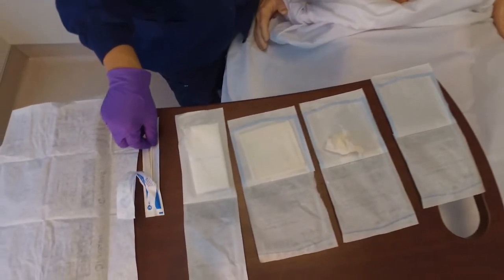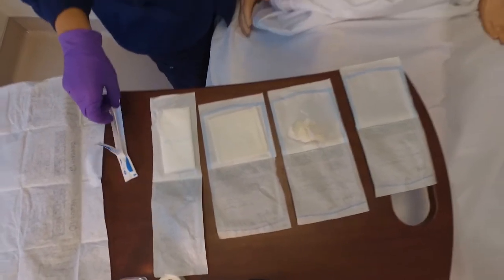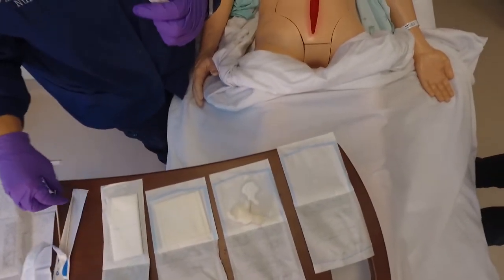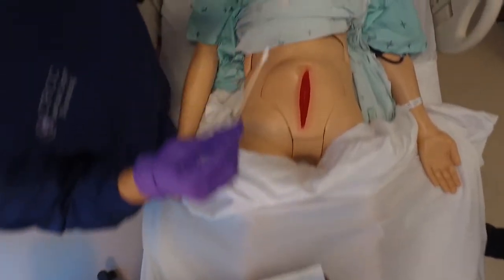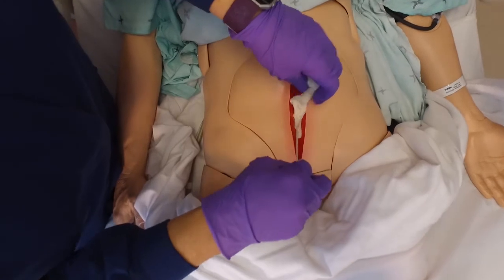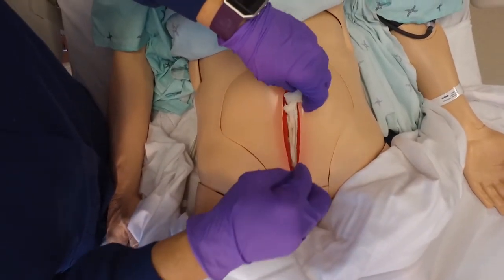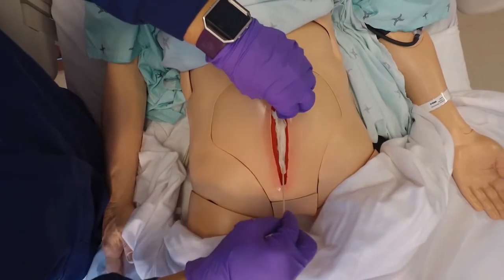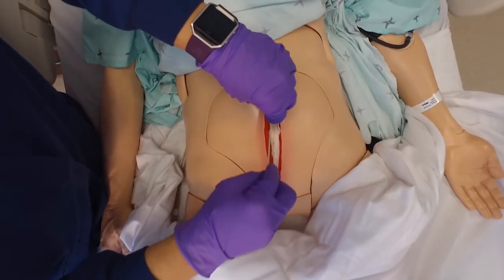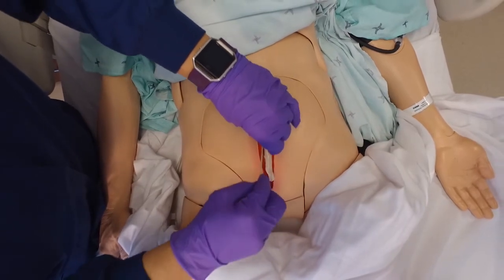The nurse applies a single layer of gauze to the wound using a cotton-tipped applicator to assist with placement. The gauze is not packed tightly, as packing the gauze can restrict blood flow and impede healing. The nurse is careful not to extend the moist dressing over the skin to avoid maceration of surrounding tissue.